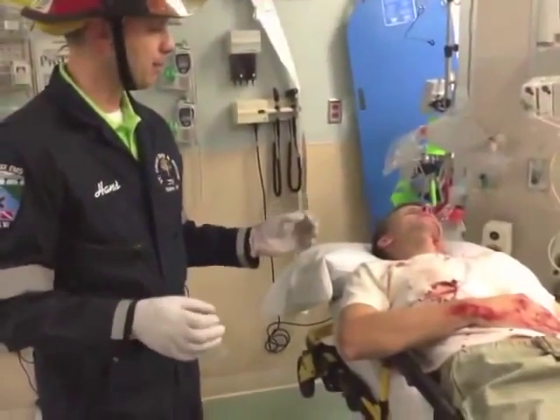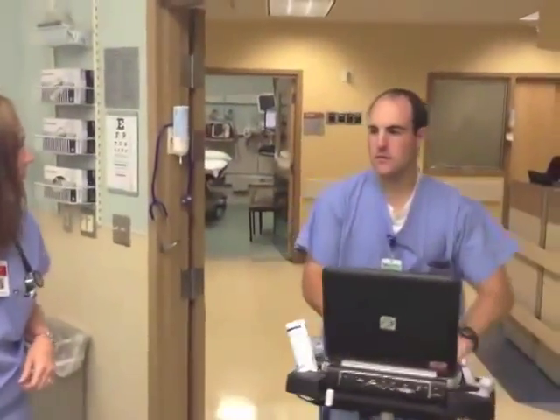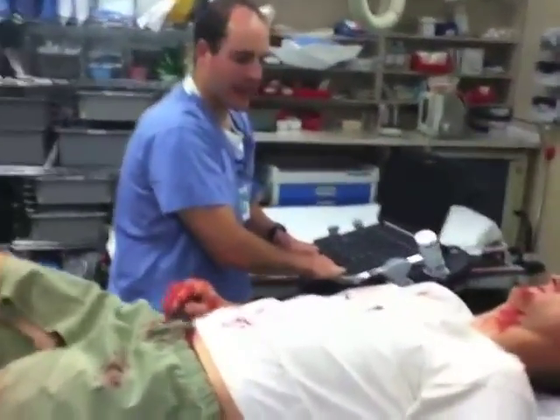Bad bike accident up in front of the hospital here, so. Okay, we need an IV, O2, monitor going. Can you come in here and do an ultrasound? Sure, Dr. Zwank. I got this.